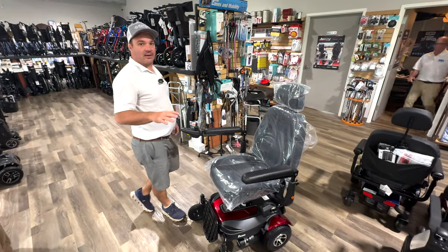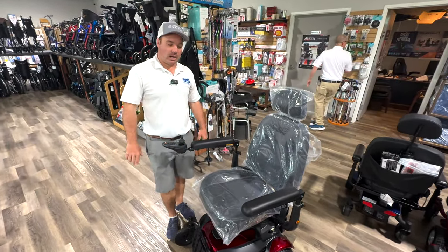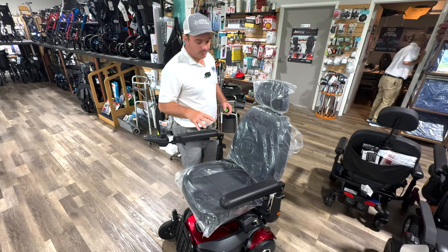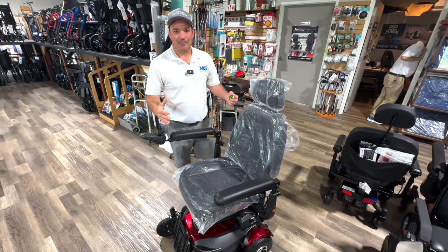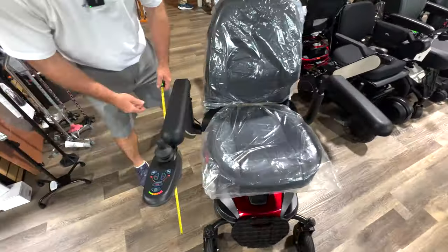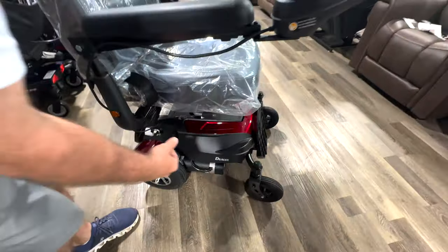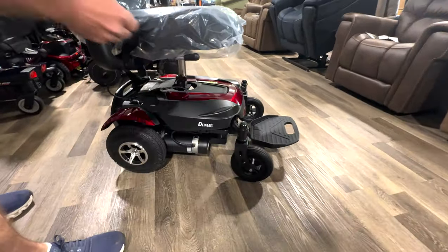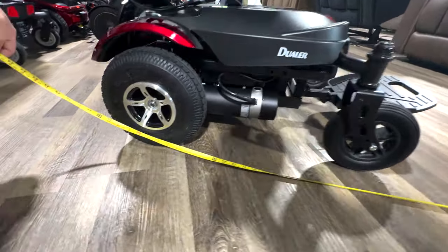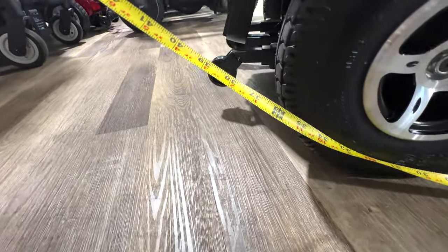There are a lot of chairs with a lift or rise feature, like the Jazzy Air 2 and some others. But this one is small and compact — not overly big front to back. With the foot plate down, it's about 43 inches in length.